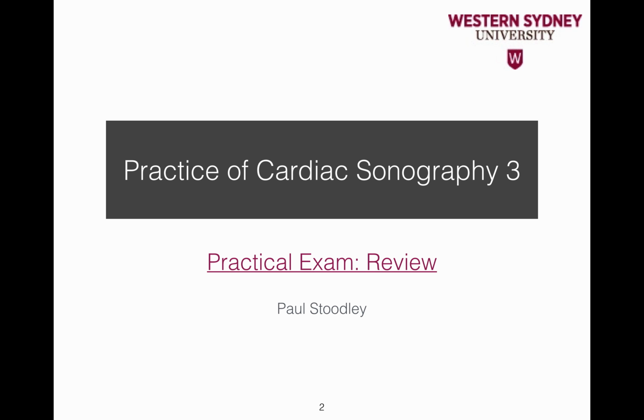The following is a review of the Practice of Cardiac Sonography 3 end of semester practical exam. The review includes the imaging tasks and questions that proved most difficult.